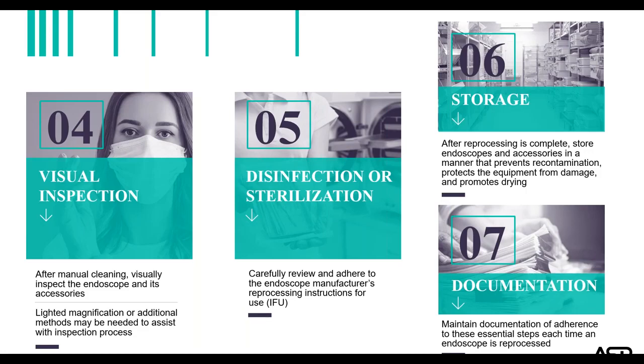For the internal filters, if they're only being changed out when they do preventative or corrective maintenance, then that should be part of that record. But if the end user is changing those out, you want to make sure that you're capturing that on a log, as well as writing the date that they're changed out on the filter itself.